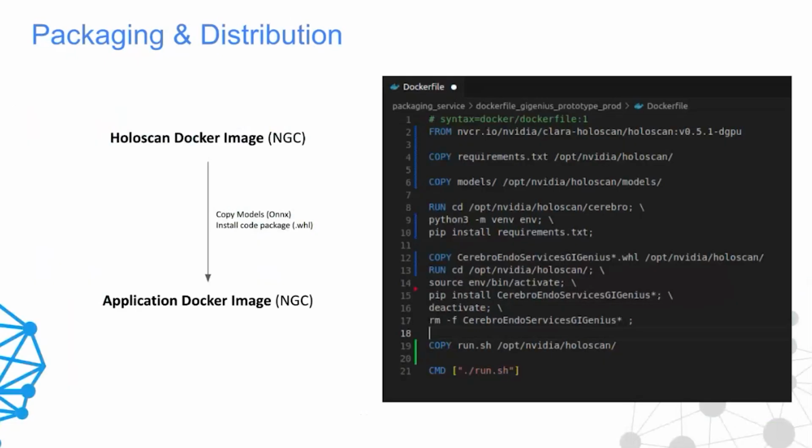In terms of packaging, Holoscan comes with the Holoscan CLI, which is very handy for packaging the applications. You just copy your models, install your code as a package, and these images can then be directly run on the intended hardware that you want to run on. This particular example shows a dGPU, basically an RTX 3000 series is what we ran it on. Similarly, for IGX Orin, you have the iGPU Holoscan image that can be used.